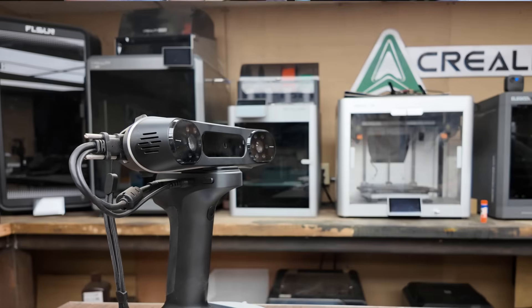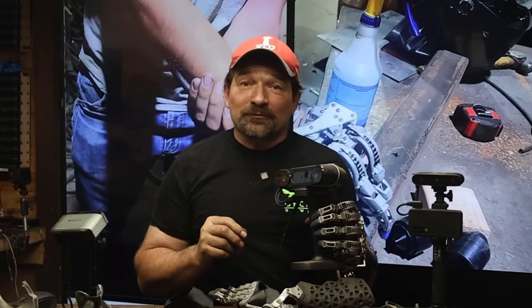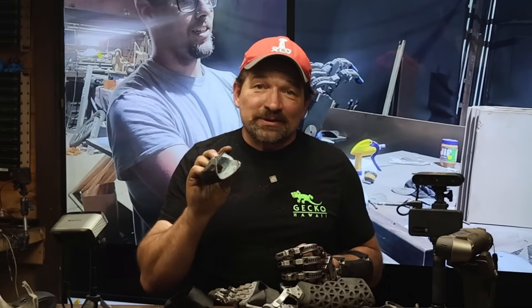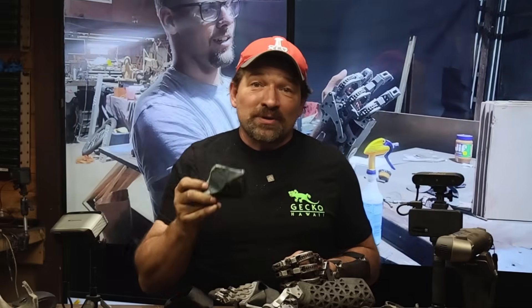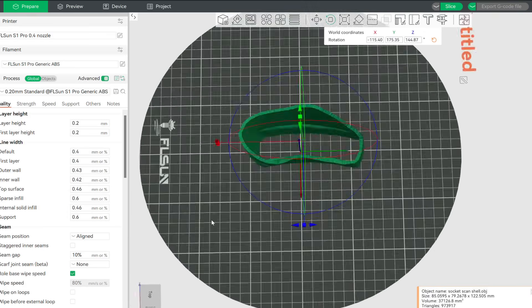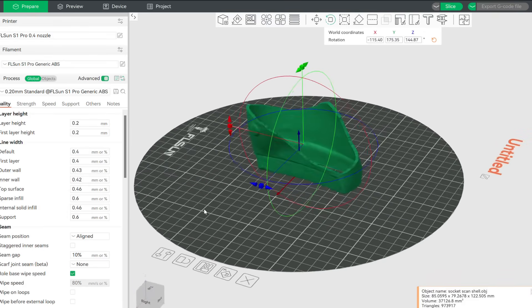Now, back to Brandon's visit. It took a couple of attempts, but I finally was able to get a complete scan of both the inside and outside of the socket. From there, I processed it using JM Studio and exported the mesh as an OBJ. I imported the file into MeshMixer and smoothed out a couple of areas where the scanner had some issues. From there, I exported the revised mesh, opened it up in the FL Sun Slicer, and printed the Rev1 sockets.